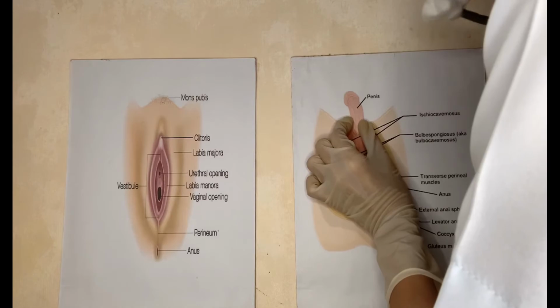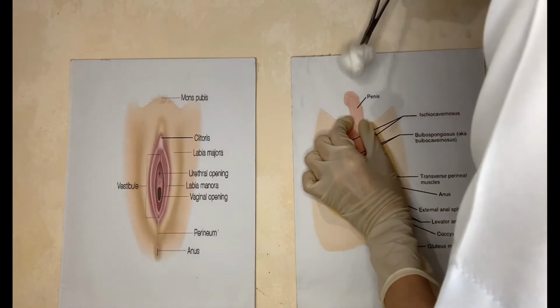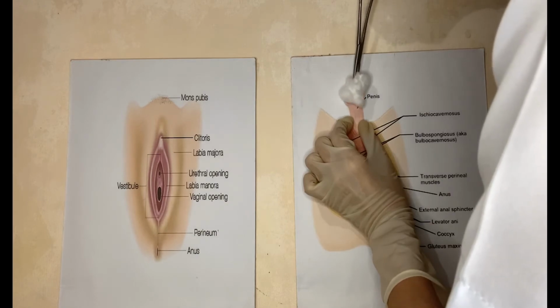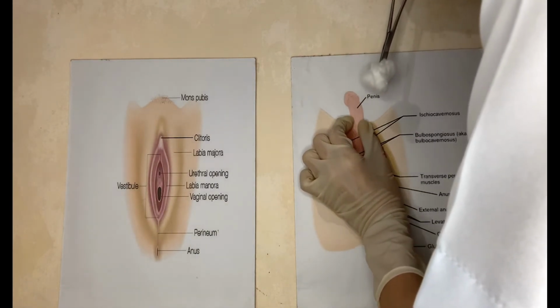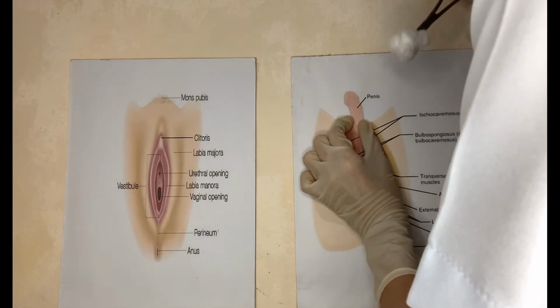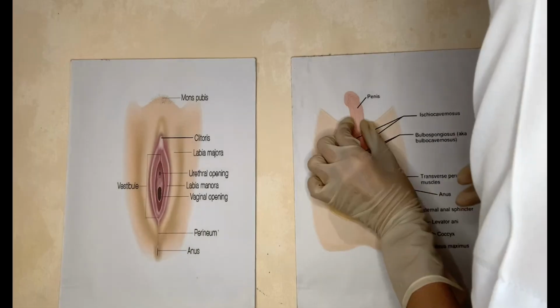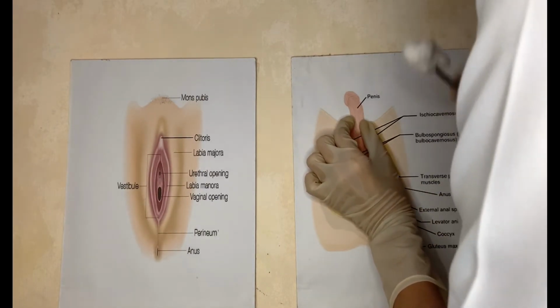Pick up a cleansing ball with the forceps in your dominant hand and wipe from the center of the meatus in a circular motion around the glans. Use great care that wiping the client does not contaminate the sterile hand. Always use a new ball and repeat 3 more times.